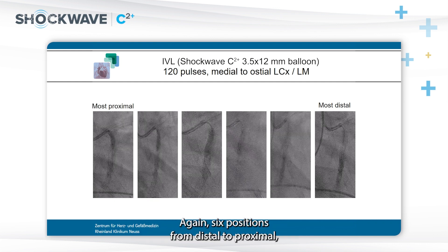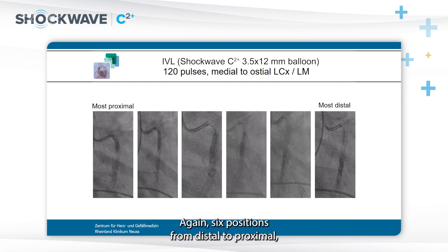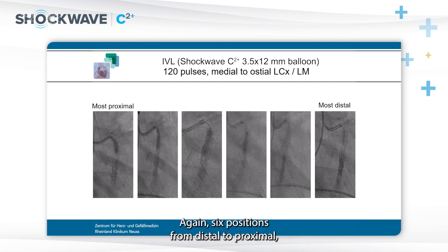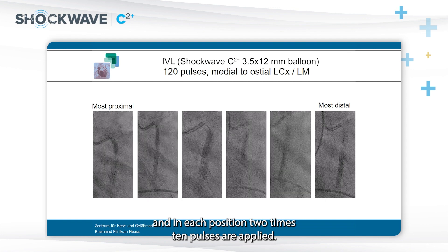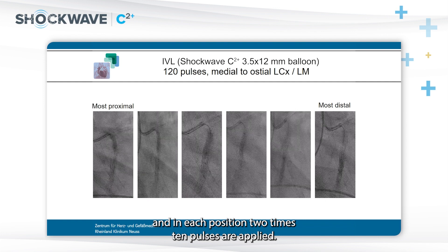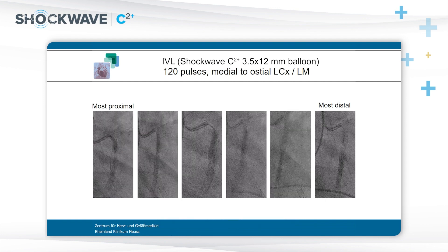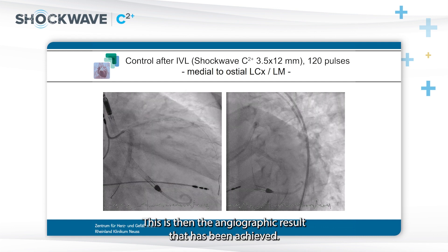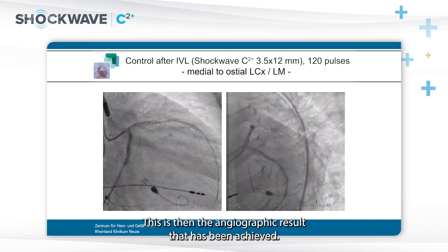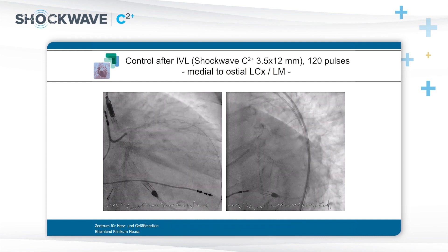Again, six positions from distal to proximal in the circumflex artery. At each position, two times 10 pulses are applied. This is then the angiographic result that has been achieved.